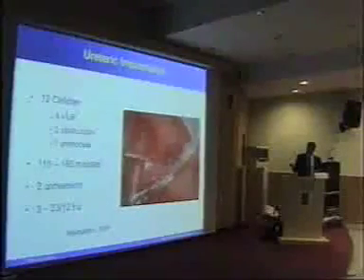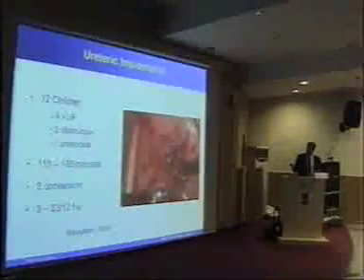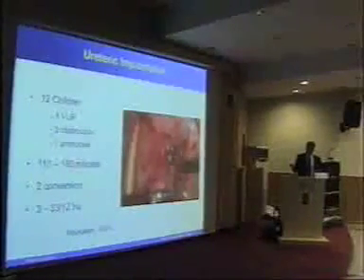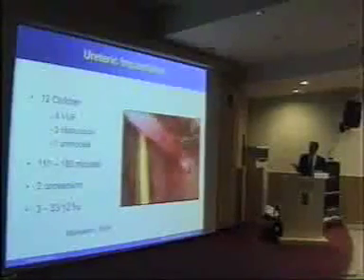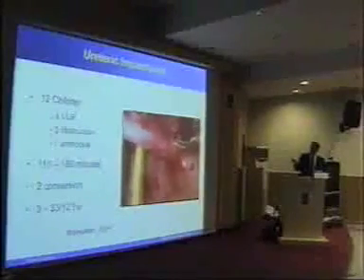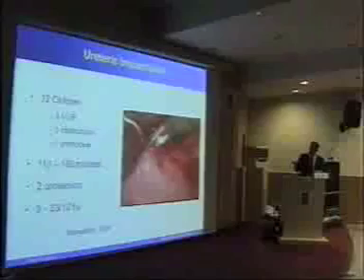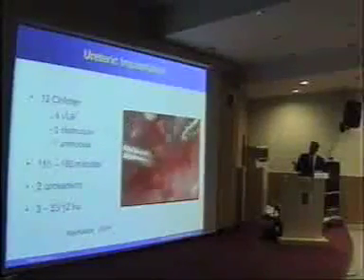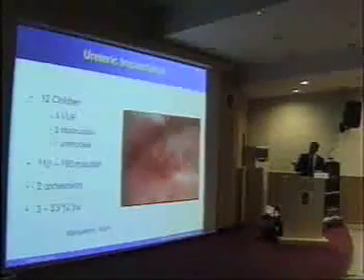And here we can see, just picking up the ureter, there's a suture, and this is dissection of the ureter into the bladder, much the same as you would do with an open reimplantation. Here's the ureter coming into the bladder here. Okay, this is the upper right edge of the trigone, and what we're doing now is making a tunnel. You can see across to the other side.